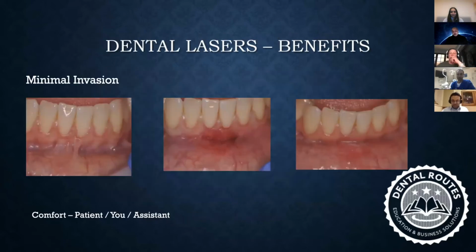Okay. And add to that, what we generally do is we have always dealt with certain additional complications while we are doing implantology on a day-to-day basis. A small example is you have a high frenal attachment just next to the implant that you have placed.